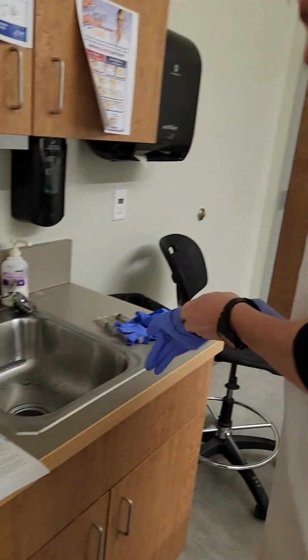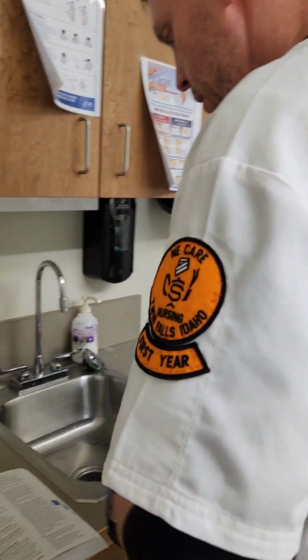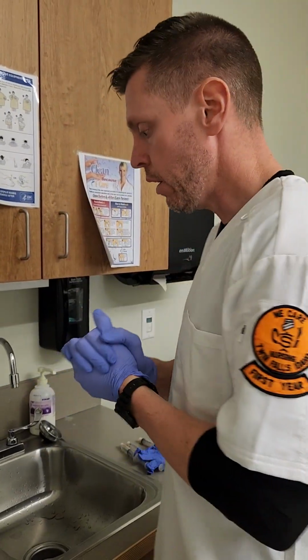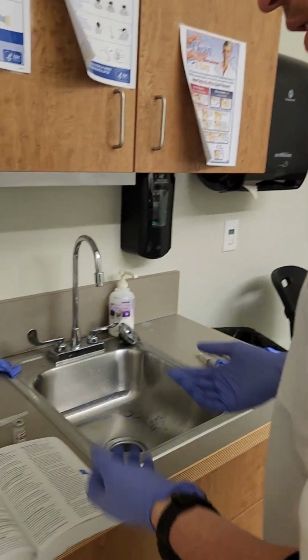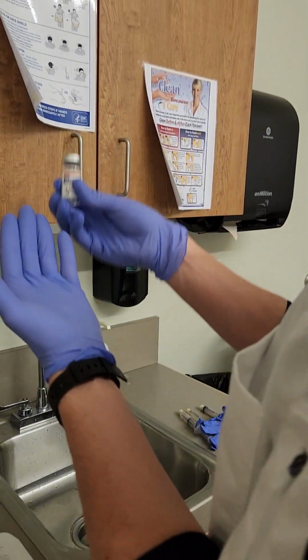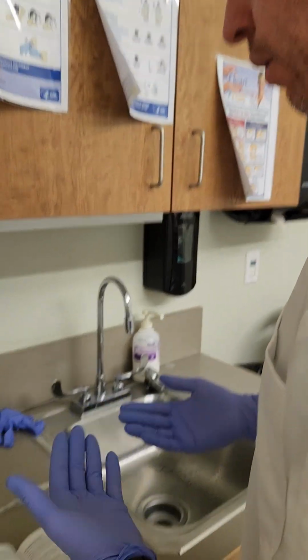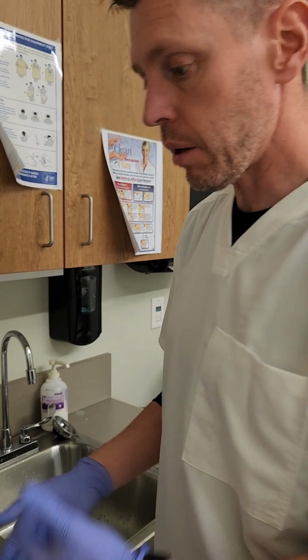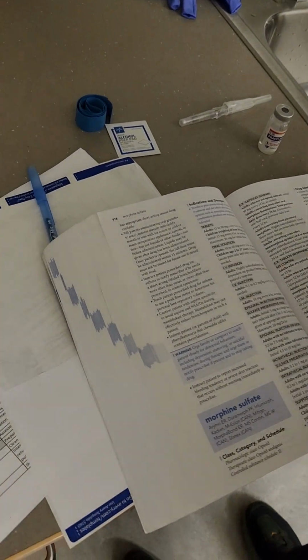So I'm going to look at the order again. I looked at it one time, which told me the reason why I was going in there. But I'm going to look at the order again for the first time and get out my morphine. And this is morphine. Okay, cool. And so I know that morphine is a drug that I want to know about, and I'm going to have to teach about. So I'm going to look it up and find out how quickly I need to give it.